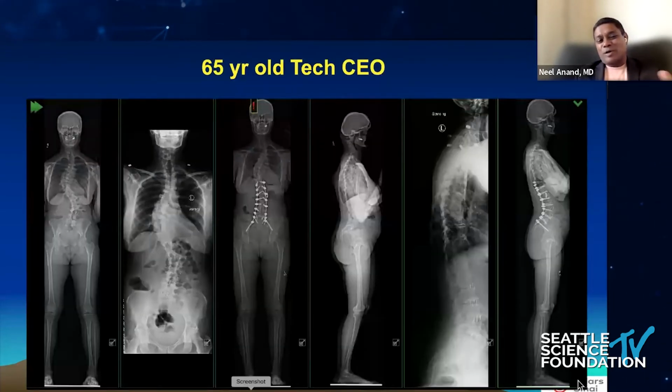Also, we can do selective thoracolumbar fusion and save the thoracic curve. Here's this patient, the double curve, as you can call it. And what you do at staging is realize you've got your correction. There's no persistent thoracic kyphosis. Patients are globally and sagittally balanced. The thoracic curve does not hurt. They do not need a T2 to pelvis. And we have a series of these.